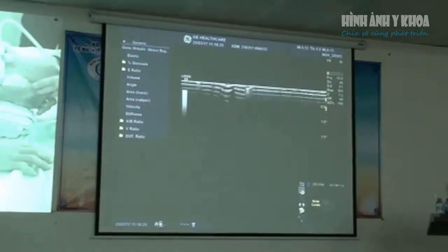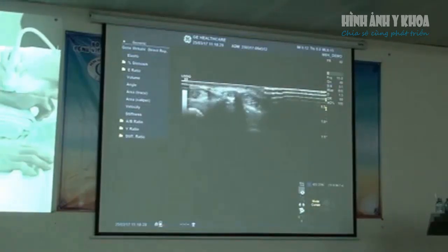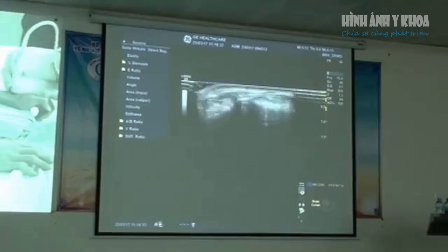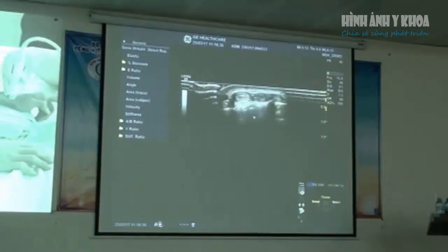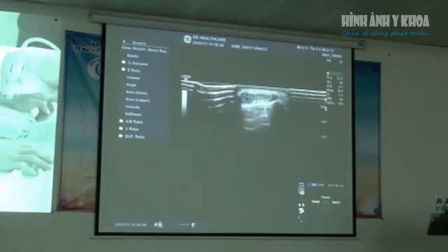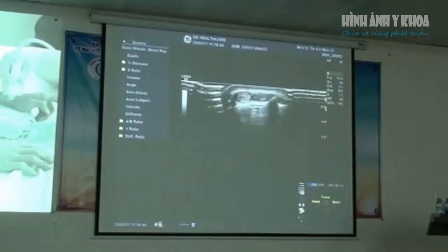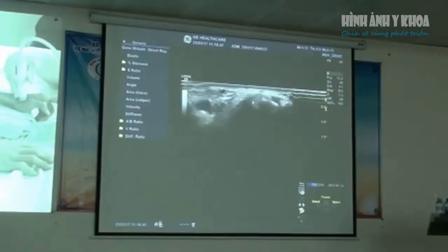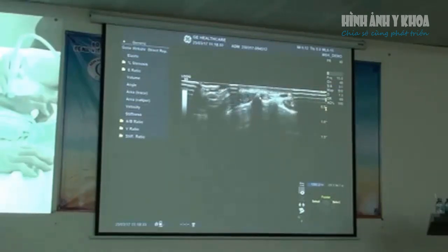To go to the next compartment — compartment two. These two here are extensor carpi radialis longus and brevis. Just lift the probe on the dorsal aspect of the wrist and then slide inferiorly to that point. This is compartment two.